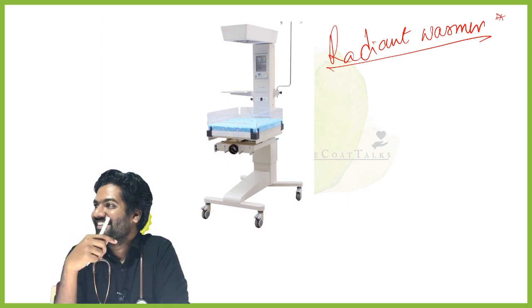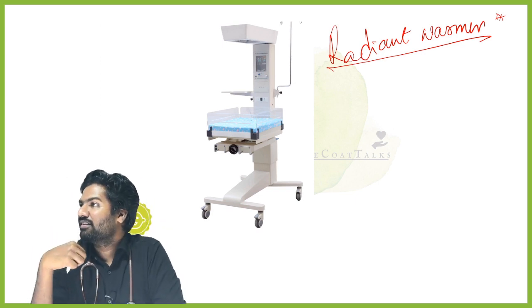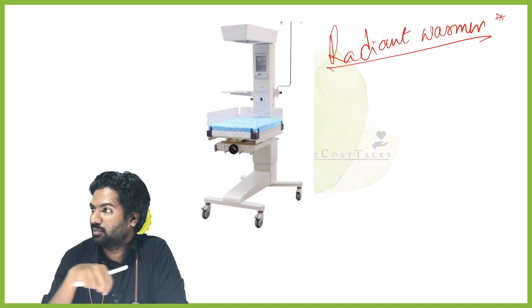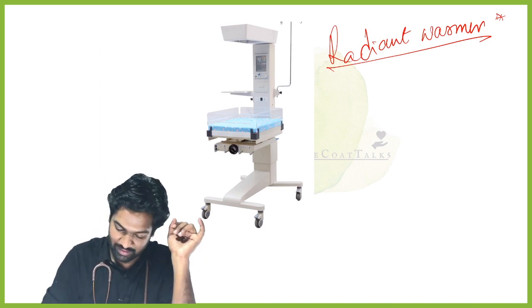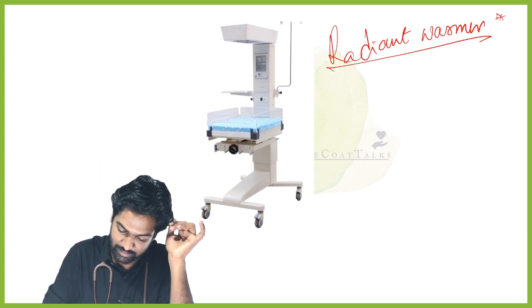Okay, fine. Am I audible? Yeah, open system. This madam Saida has said open system. What do you think then the incubator is? The incubator is a closed system. Fine. Keep that with you for the time being; we'll discuss it once again when you see it. For the radiant warmer, the heat production is definitely via radiation.